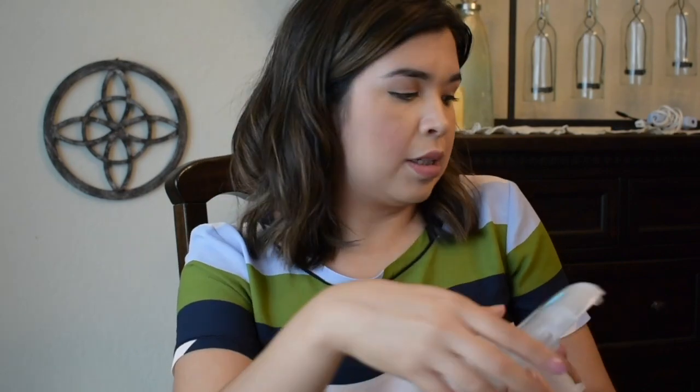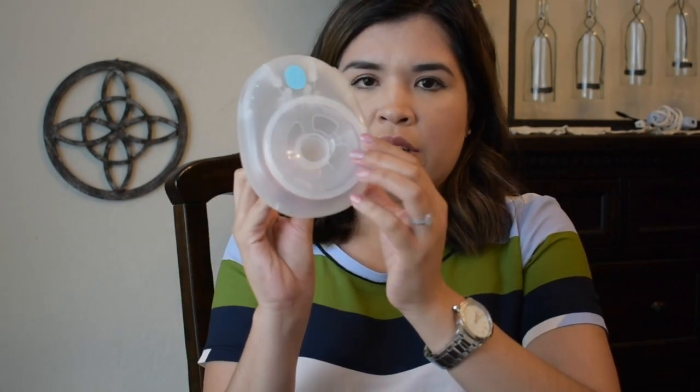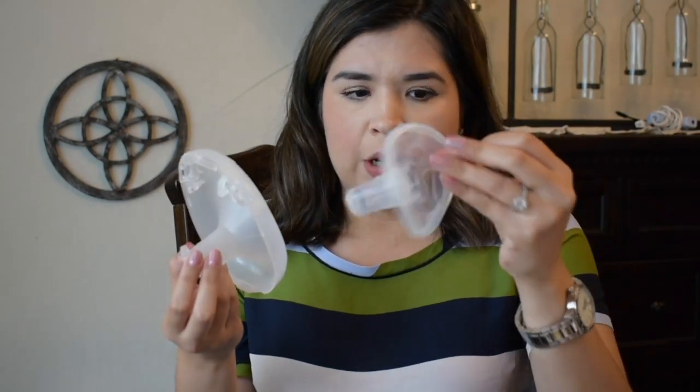I was only getting about 0.2 ounces, getting a lot of air in my bag, and my nipple would be sore and turn color. Using the Maymom reducer helped a little — I'd get about one ounce — but it was still pretty painful even with nipple balm. So I stopped using those and bought Amida flexi shields. They're made of soft silicone, recommended in a Facebook breastfeeding group, and designed to massage your breast during pumping to help increase output.